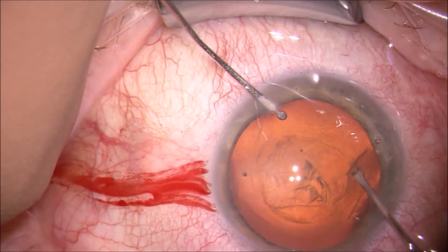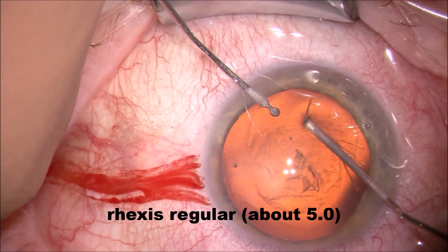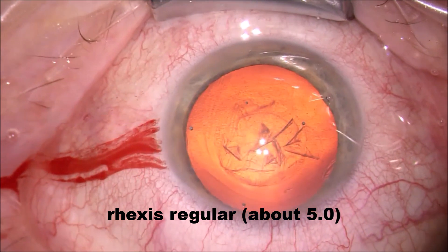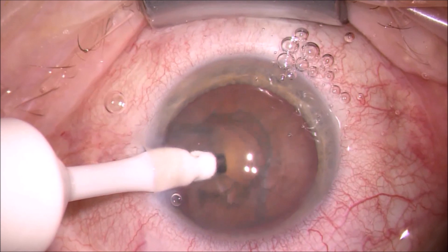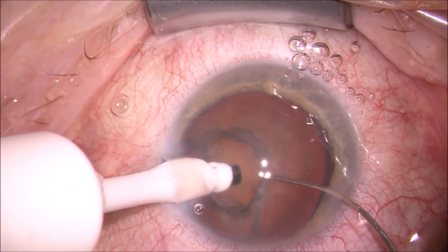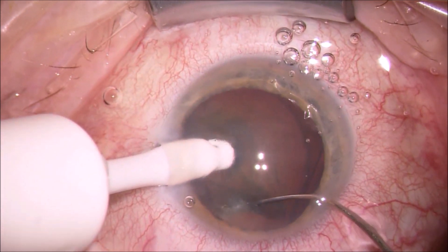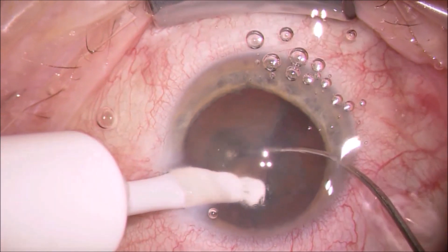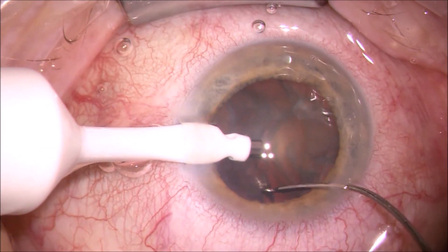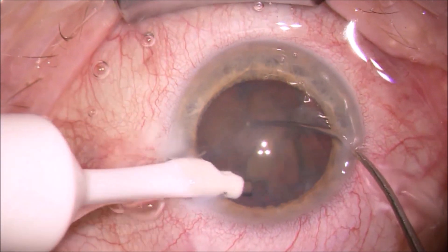The paracentesis is designed to be a bit longer and not all the way through in order to have more stabilization of the anterior chamber. The rexis is pretty much 5.0 diameter, nothing fancy. I would always suggest starting with peri- or para-retrobulbar anesthesia or under general anesthesia for your first couple of hundred cases, especially if you perform this in an outpatient setting.